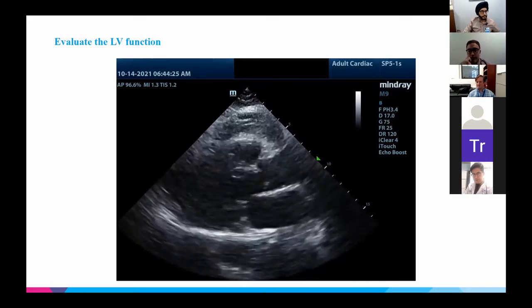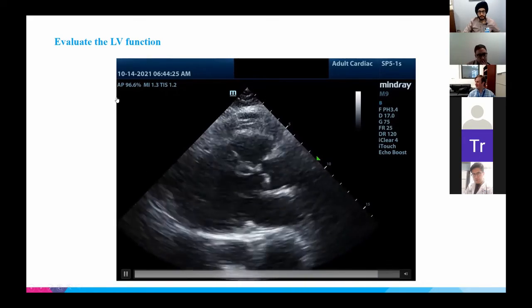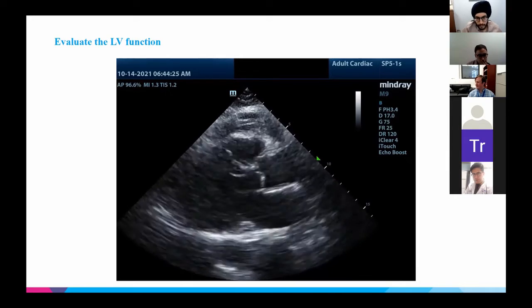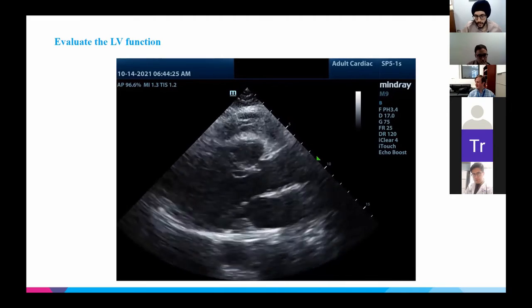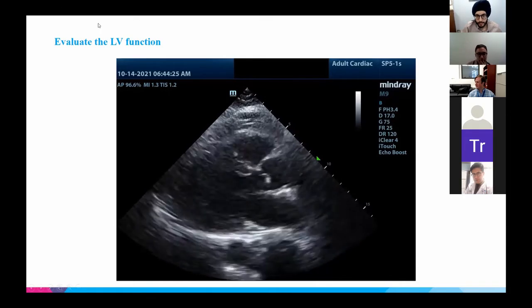And then what's our view here, guys? Who's telling us the view? Yeah, parasternal long, right?